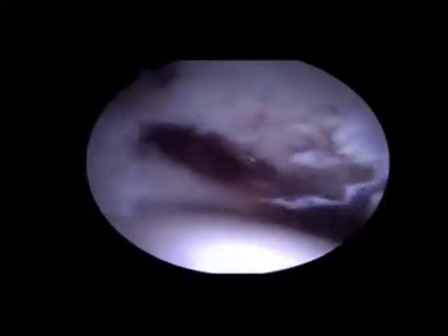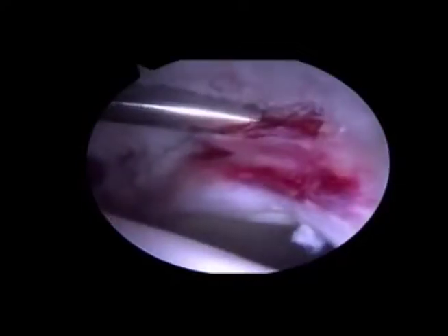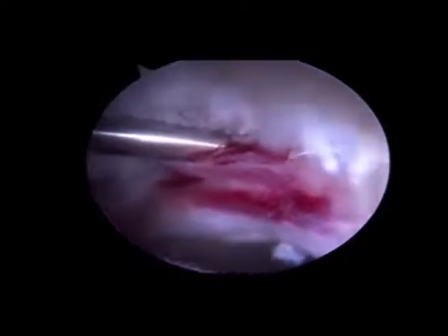After gaining access to the hip joint, an interportal capsulotomy extending from the mid-anterior to the anterior lateral portal is performed with a banana blade. The anterior lateral portal is used as the viewing portal while the mid-anterior is the working portal in the initial part of the procedure. A complete diagnostic evaluation of the hip joint is performed, including evaluation of the labrum, articular cartilage, and the lunate fossa. Bruising of the labrum secondary to impingement is identified in the lateral labrum with some labral chondral disruption anteriorly.